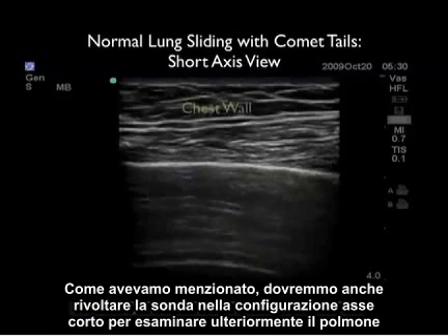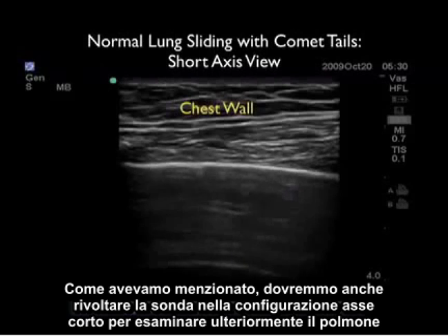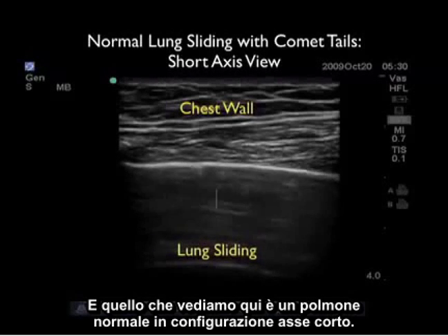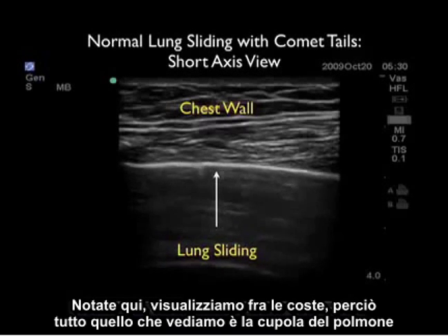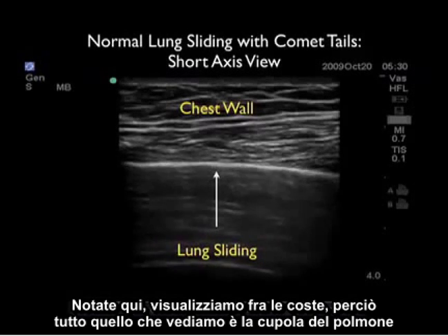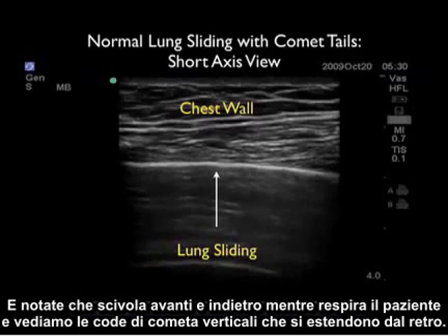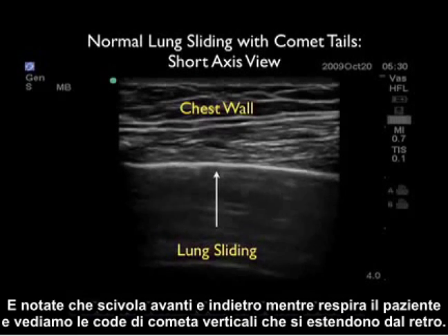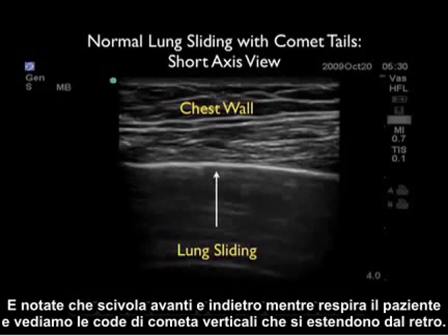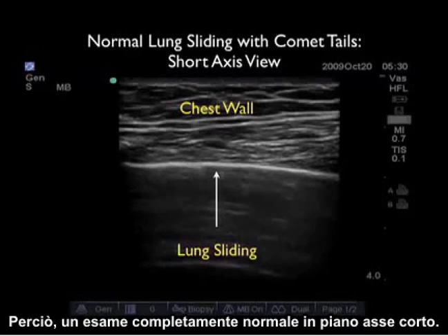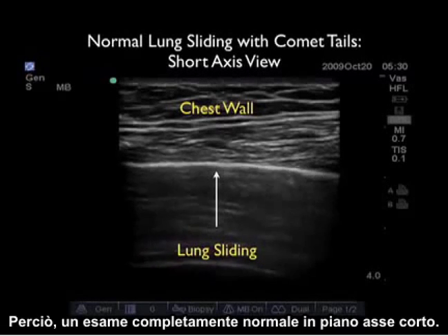We should also swivel the probe into the short axis configuration to further examine the lung. Here we have a normal lung in short axis configuration. We're looking in between the ribs, so all we see is the dome of the lung. Notice that it slides back and forth as the patient breathes, and we see the vertical comet tails coming off the back — a completely normal examination in the short axis plane.